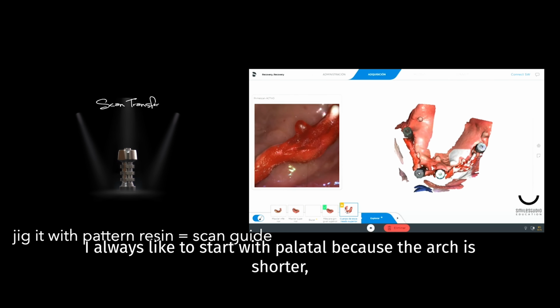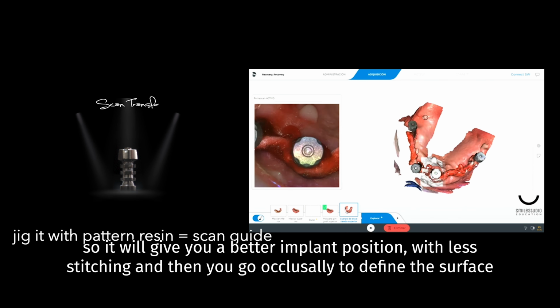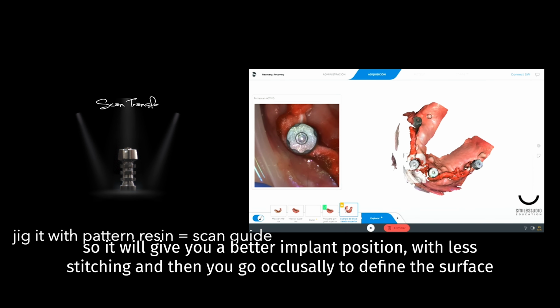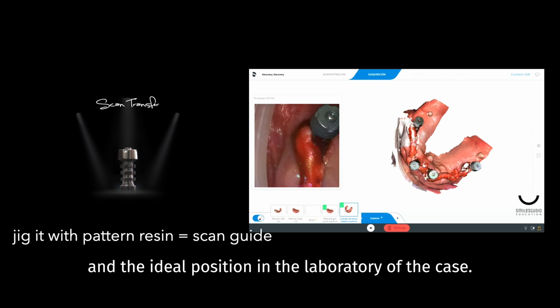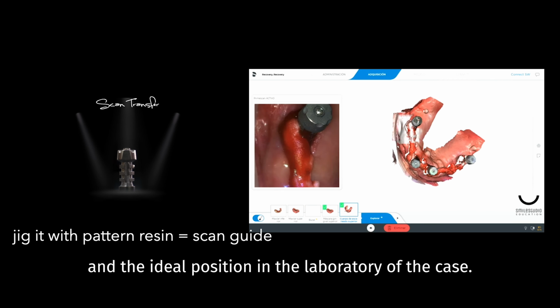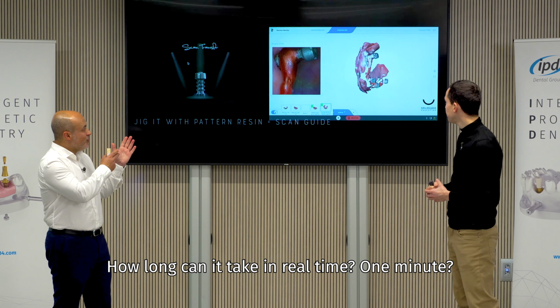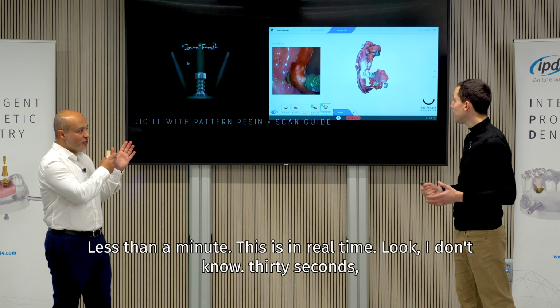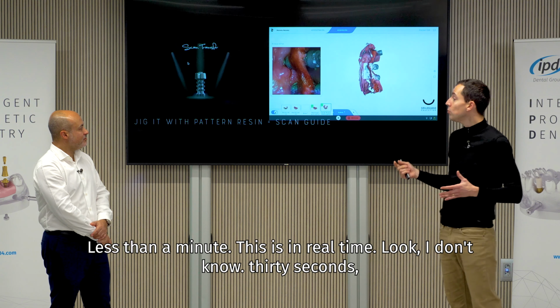I always like to start with palatal because the arch is shorter, so it will give you a better implant position with less stitching, and then you go occlusally to define the surface and the ideal position in the laboratory of the case. How long can it take in real time? 1 minute? Less than a minute. This is in real time. Look, I don't know. 30 seconds, 35 seconds.